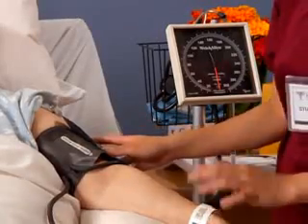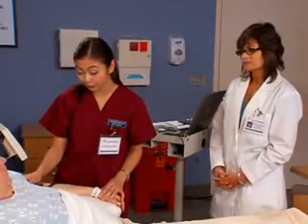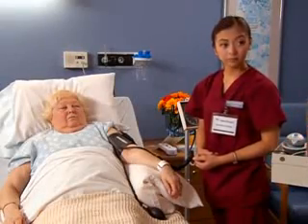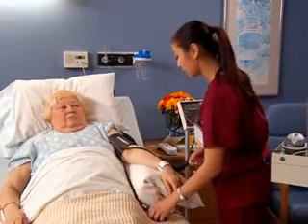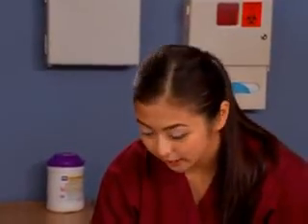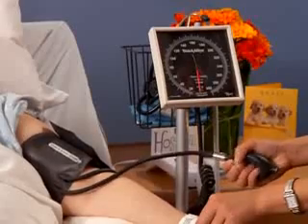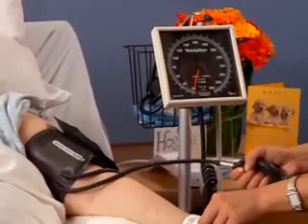Good. Now, I'm going to estimate your systolic pressure, which will help make sure I get an accurate reading. That's good. Estimating the systolic pressure prevents inaccurate readings if there's a pause in the auscultated sounds. Okay, now I'm going to inflate the cuff. It's going to feel a little tight. That's okay. I had 3 children. I can certainly handle this. Note the point on the gauge where the pulse disappears.